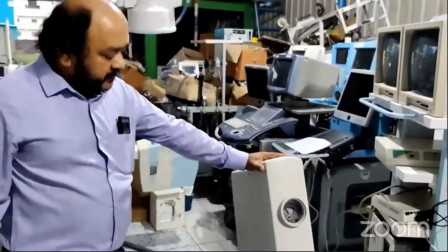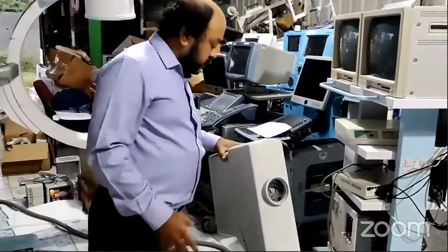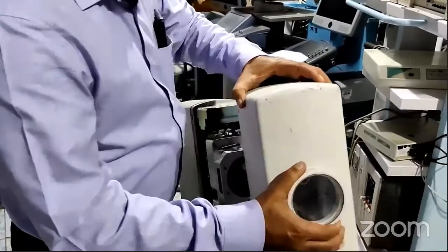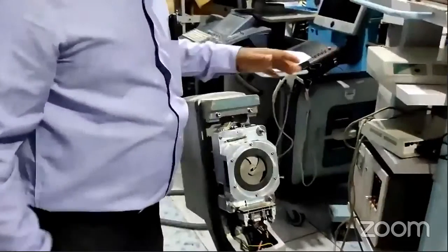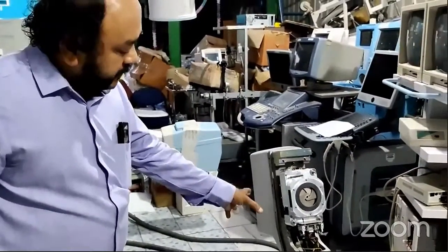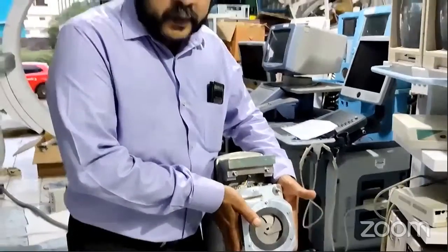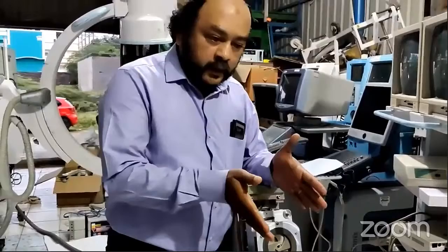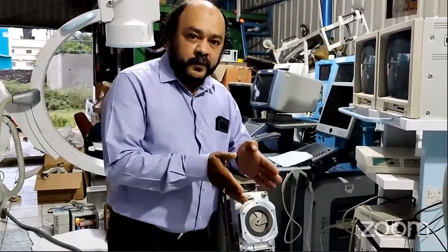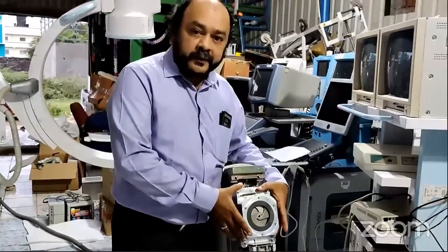Now we will open this X-ray section. See, this is the X-ray generator. From this, again, it's called a collimator. Suppose you want to take the image. It's called a region of interest, so a particular point you want to focus on and you take it. You need the collimator. This collimator you can also adjust through the keyboard, how much shape you want.